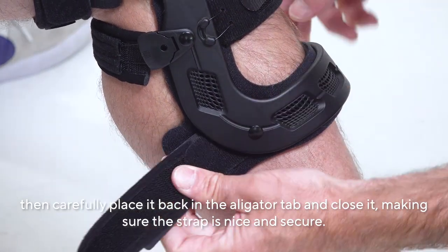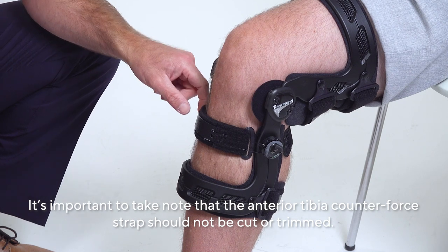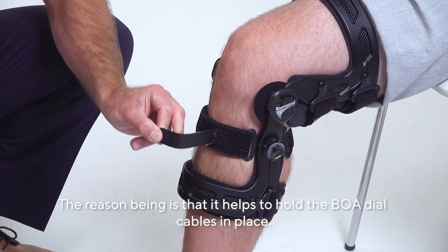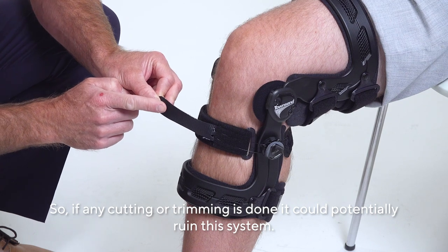It's important to note that the anterior tibia counterforce strap should not be cut or trimmed. The reason is that it helps to hold the BOA dial cables in place, and if any cutting or trimming is done, it could potentially ruin this system.